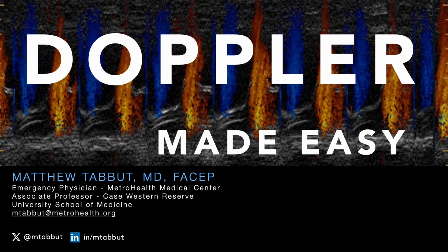All right, so today's topic is Doppler ultrasound made easy. And yes, it's a little bit of a clickbaity title, but the whole point of this is to really get us into this notion of doing Doppler ultrasound and kind of demystify, simplify it a little bit.